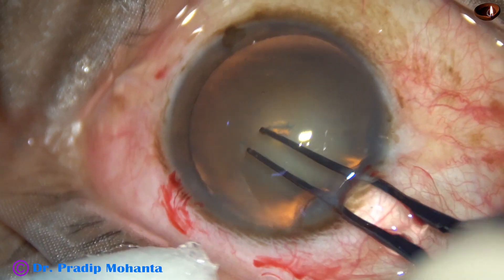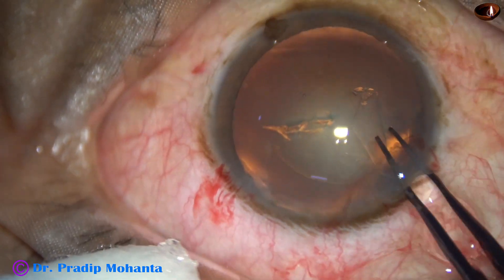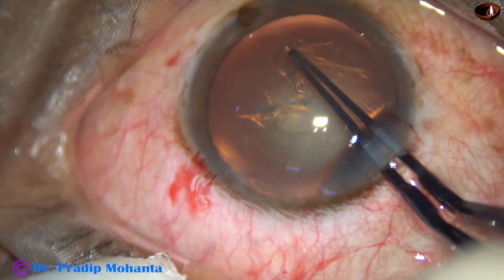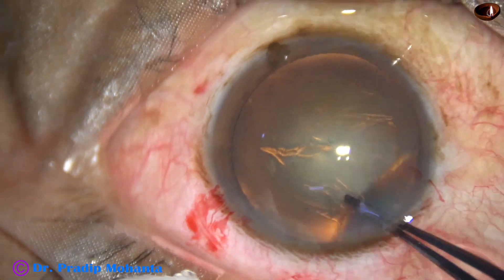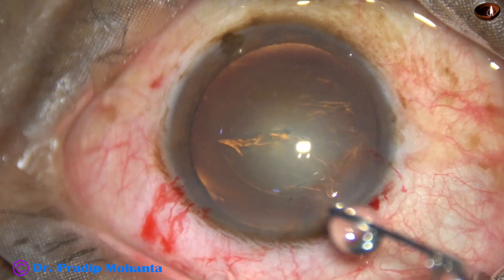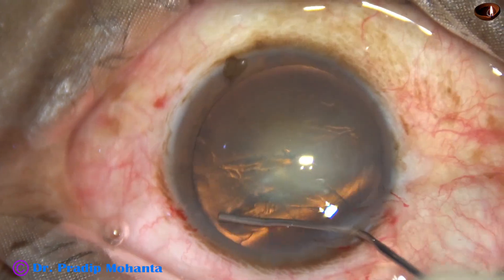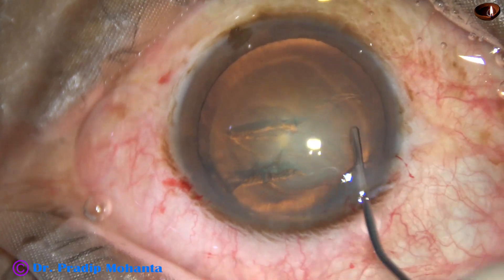Capsulorhexis — the anterior capsule is torn by the tip of the utrata forceps. The capsular tag is raised and guided anti-clockwise, and an optimum-sized rhexis of about 5.5 millimeters is performed. Now hydrodissection with BSS using a 27-gauge cannula.